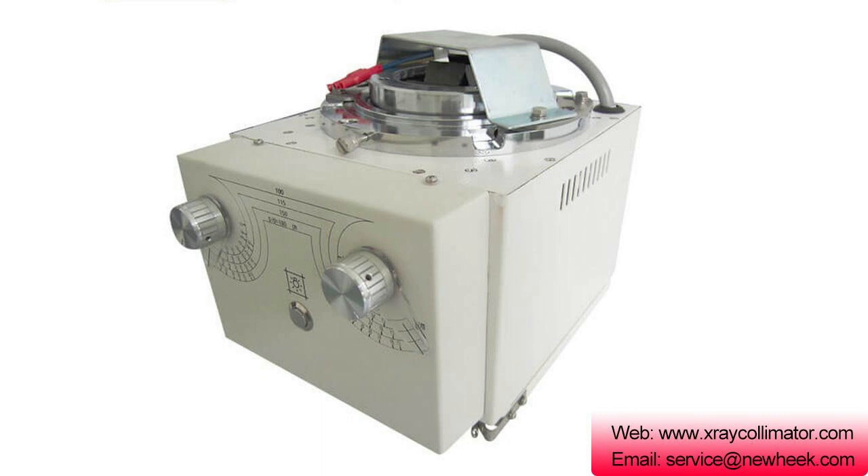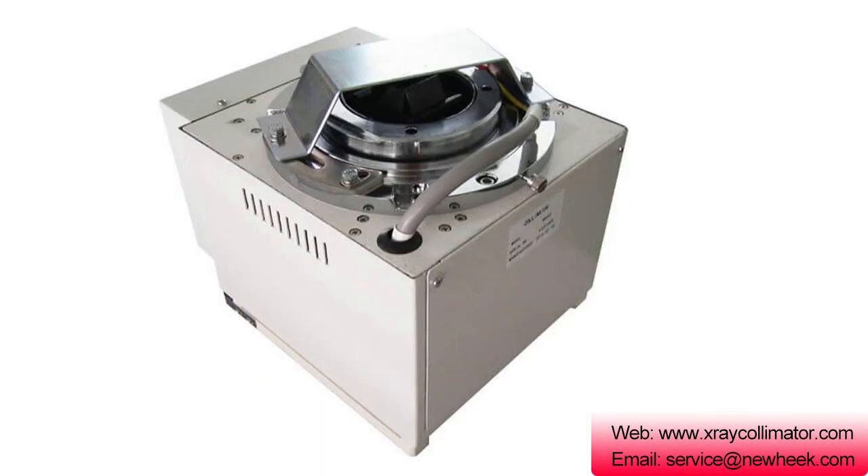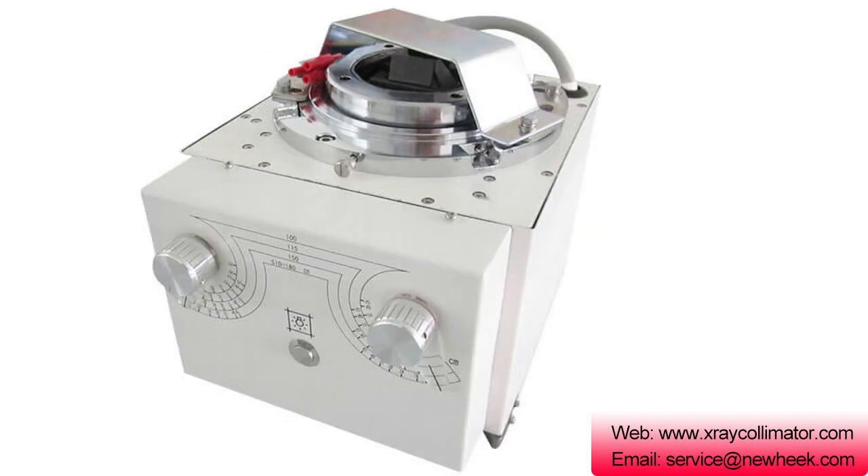The NK-102 is mainly used for 150 kV tube and stationary X-ray machines. If you want to know more about the X-ray collimator, please feel free to contact us.